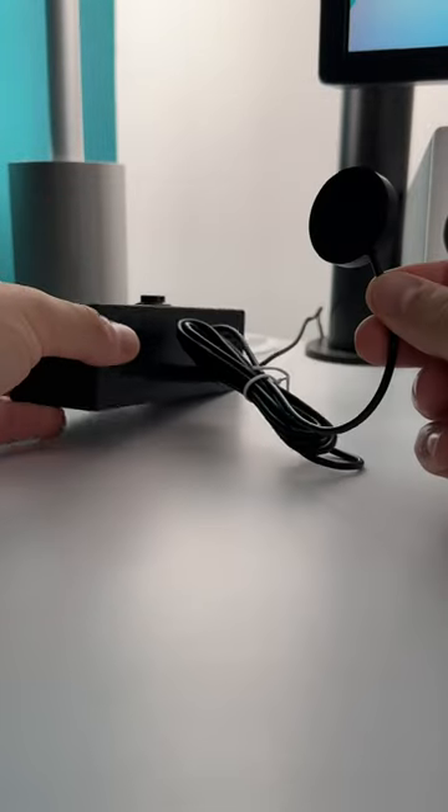There's an included vibrating puck for vibration alerts, useful for those who are hard of hearing or so no one else wakes up.